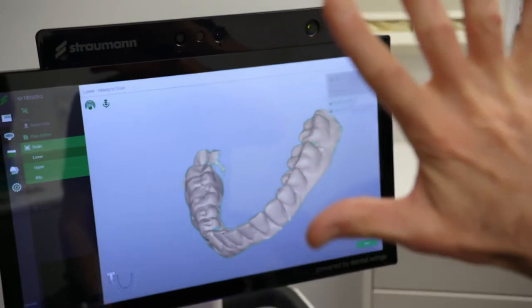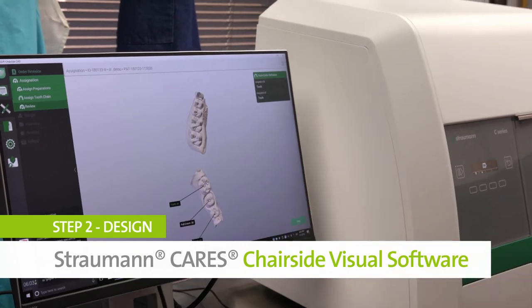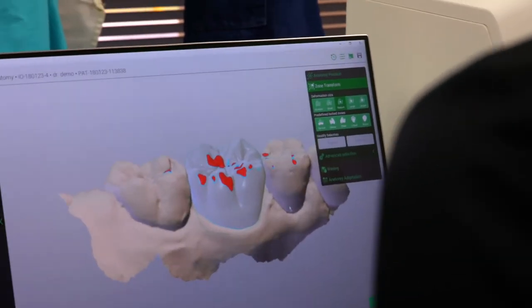It needs to see five fingers. I'm going to show you the actual design software. What it's doing is actually reading all of the adjacent teeth. That's the actual version of the final product.